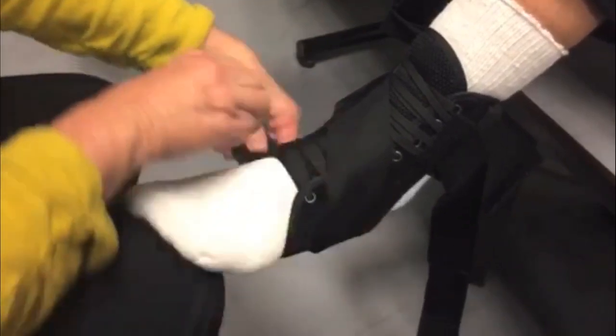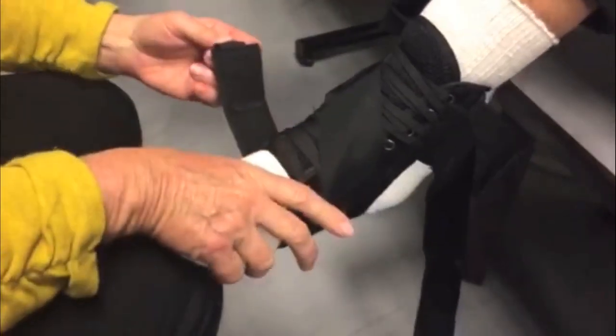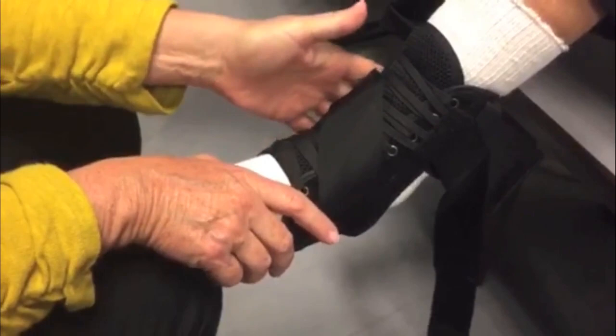Bring the inside or medial stabilizing strap across the top of the foot and under the heel. Attach the loop end of the strap to the hook side of the brace on the medial side.